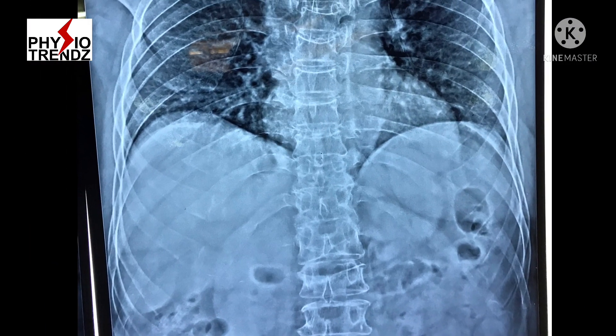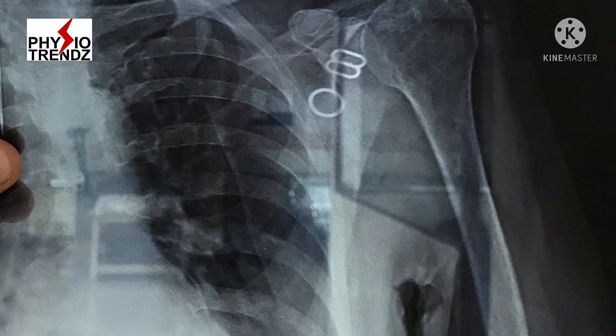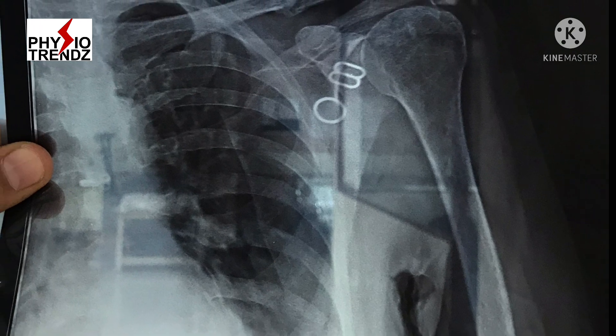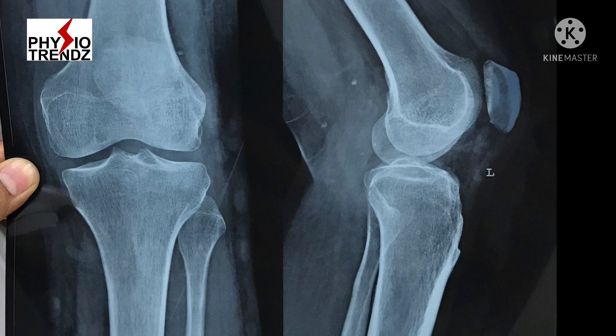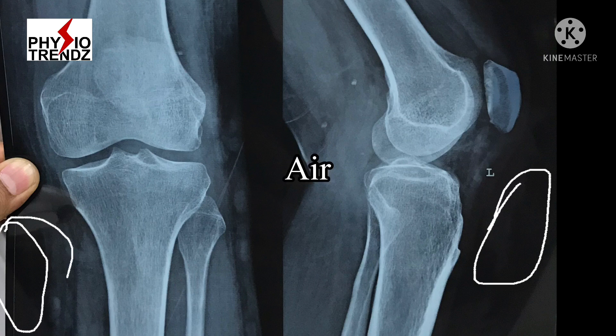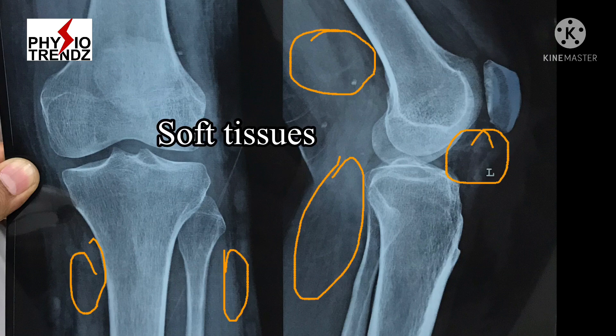We all know x-ray is different shades of black and white film, and these shades help us to identify different structures. In this knee joint x-ray, black color signifies presence of air, dark gray color shows fat layers surrounding the muscles, and light gray color spots soft tissues surrounding the bone.